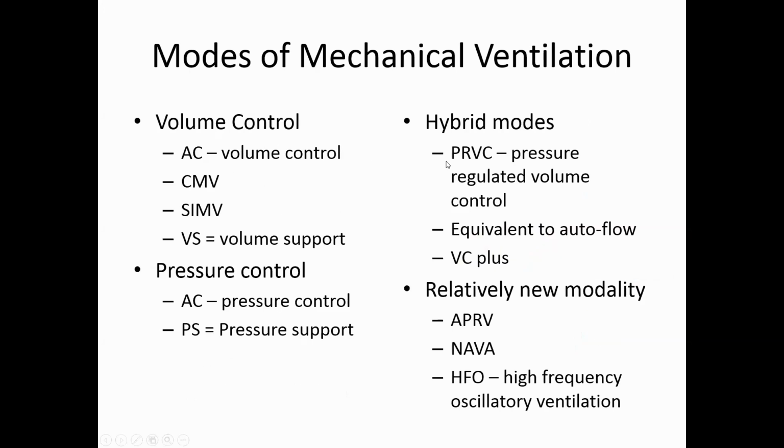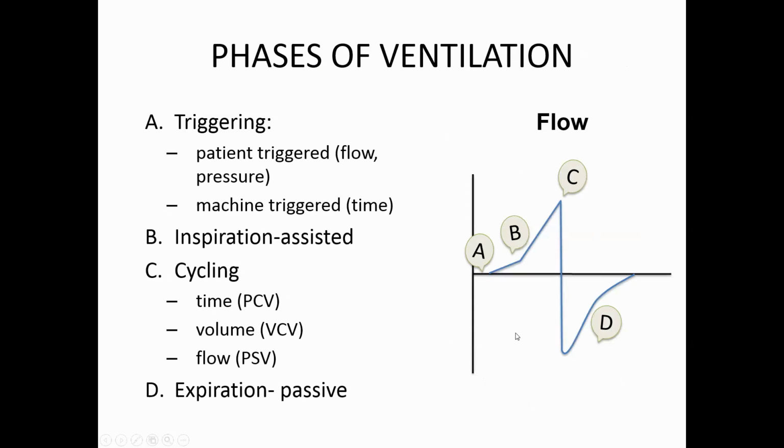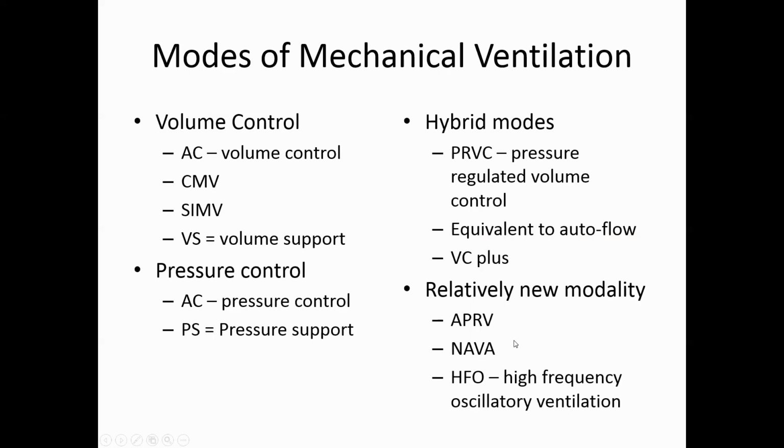And these are the most commonly used modes, but actually with the newer ventilators, everybody is doing hybrid. That graph over here is still applicable, but how to set it up is by the combination of pressure regulation to guarantee a certain breath to be given.